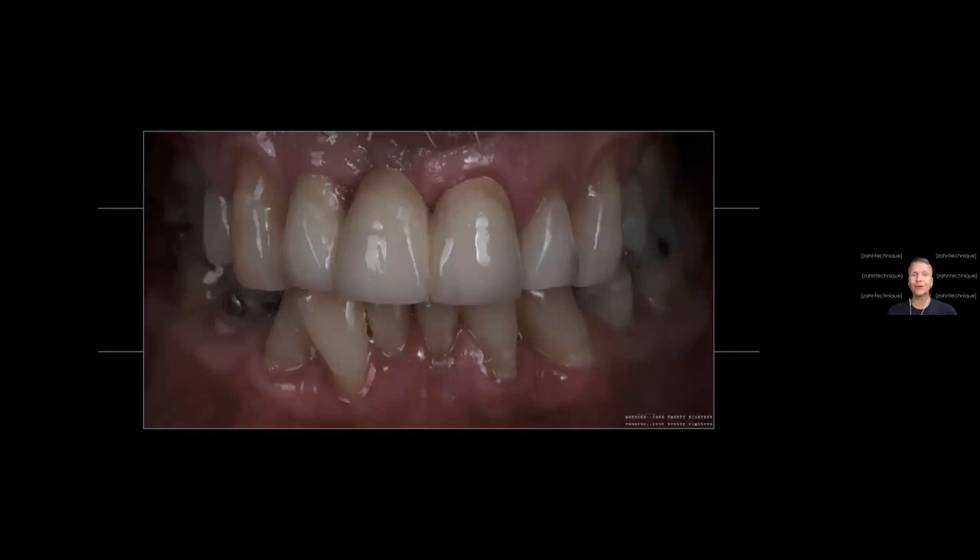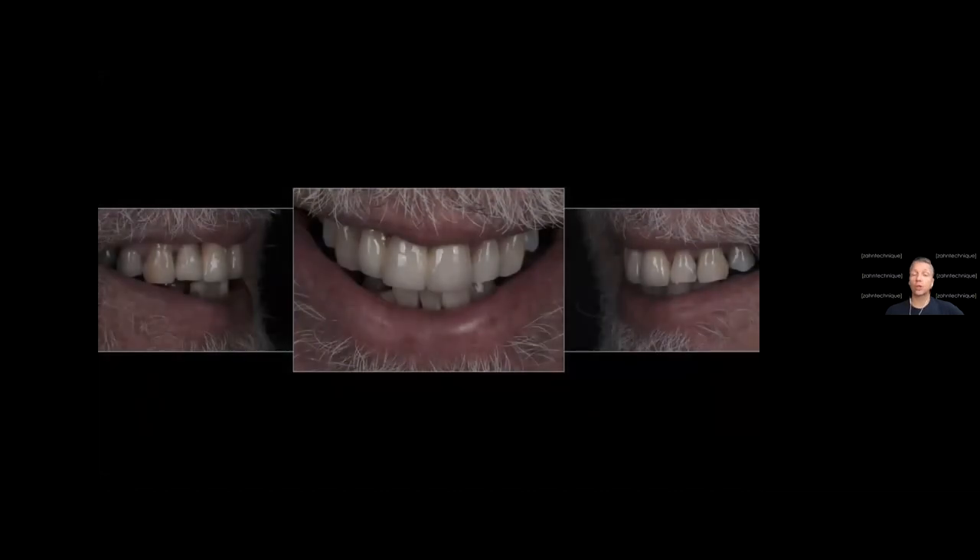As the final beauty shot, we used a special flash we call 'the donut' — I'll show it in a few slides. This is a very special flash we use to make everything nice and glossy, with everything highlighted as it should be, blending everything nicely. It's a beauty shot. It's not overexposed — it's rather a hair underexposed, meaning slightly on the darker side, so I can adjust the exposure on a computer to bring it up if needed.